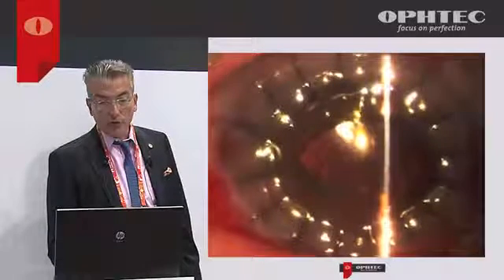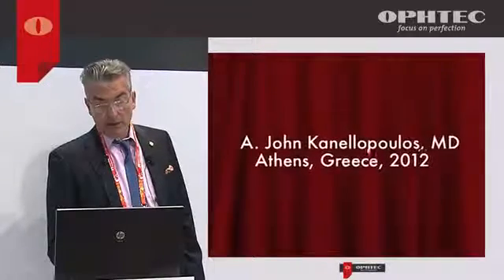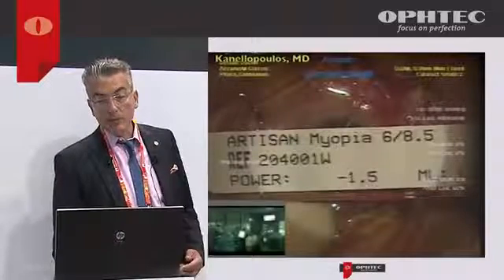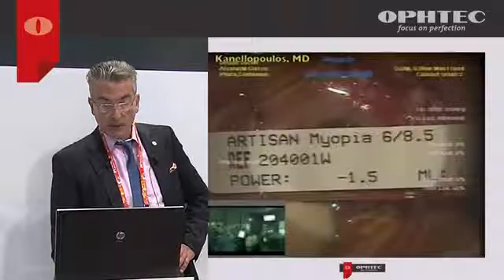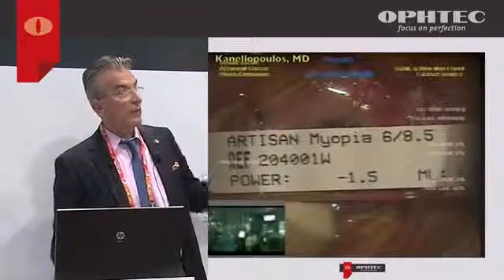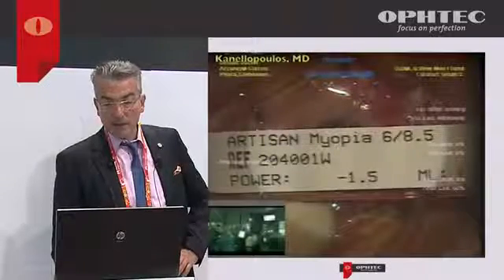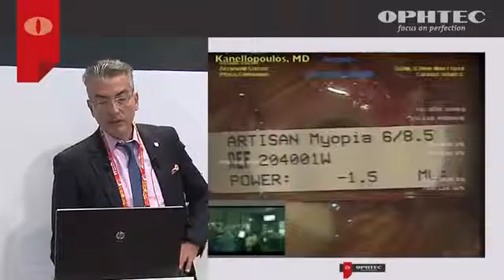Again, I'm preferring to go the scleral route here, a conjunctival peritomy, a corneoscleral incision. I'm going here almost 2.5 millimeters posterior to the limbus, creating my scleral tunnel, and a little Miochol here to attain miosis. And again, same concept. This is our lens, IOL power calculation with the A constant you saw before. We're using the 116.9, so almost 117.